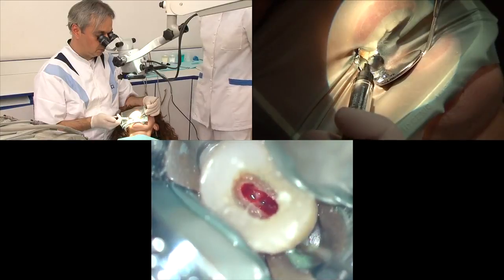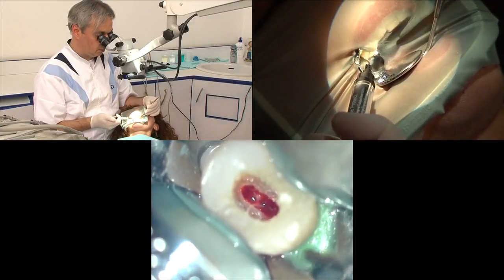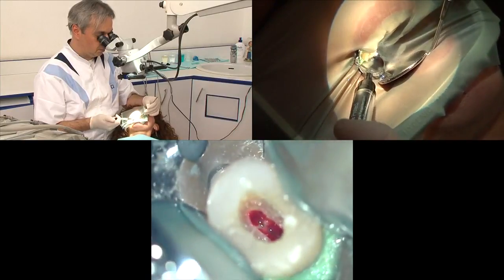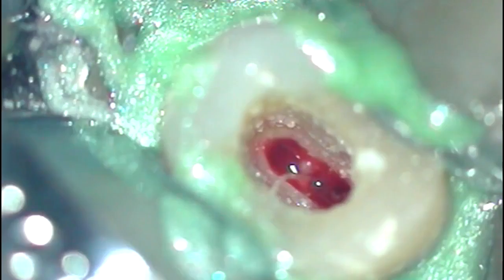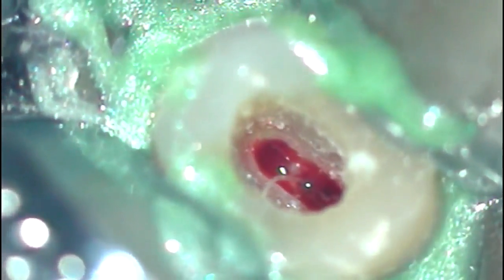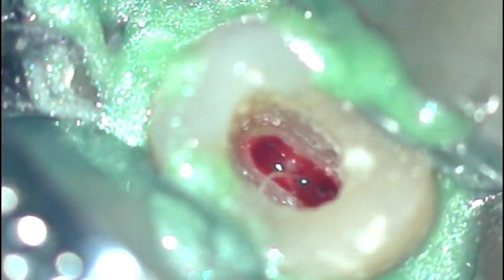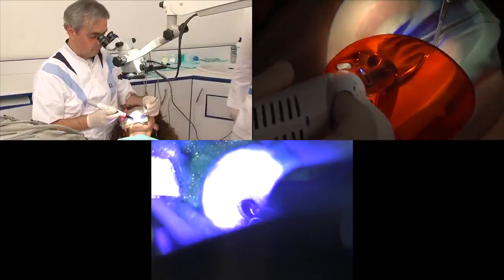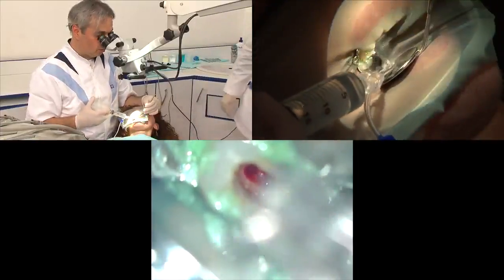The case was an upper premolar — a vital case. All the caries was taken out and the tooth was rebuilt. We are now seeing the gel that is going to act as a perfect seal at the junction for the rubber dam.